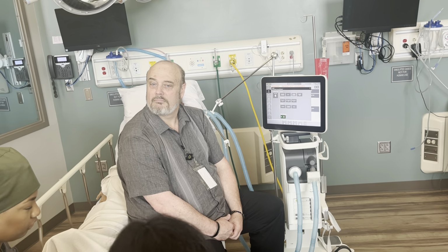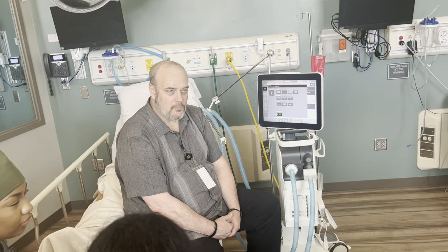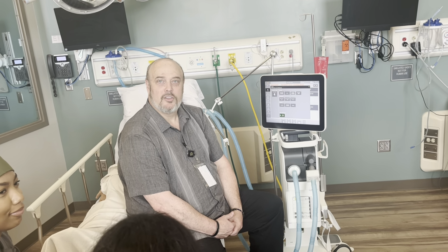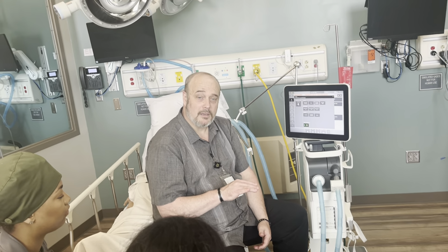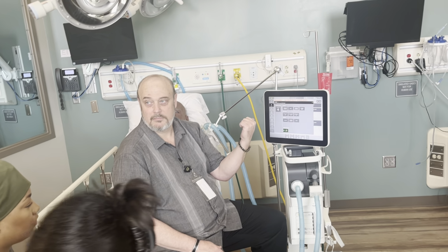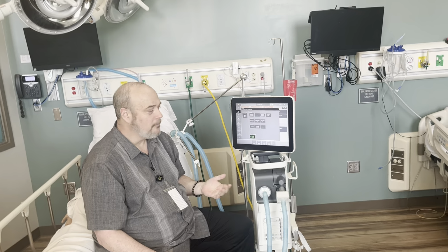CPAP is also providing inspiratory support. No? There's something PEEP has, a rate. Pressure. Huh? PEEP has a rate. Very good. There's all these subtle little things that we're going to talk about, and these subtle little things make a difference. PEEP, like you said, is expiratory, which means there's a mechanical rate. Okay. If there's no mechanical rate, then it's called CPAP, right?